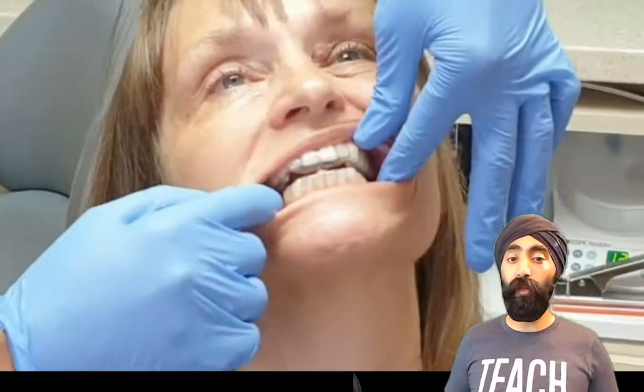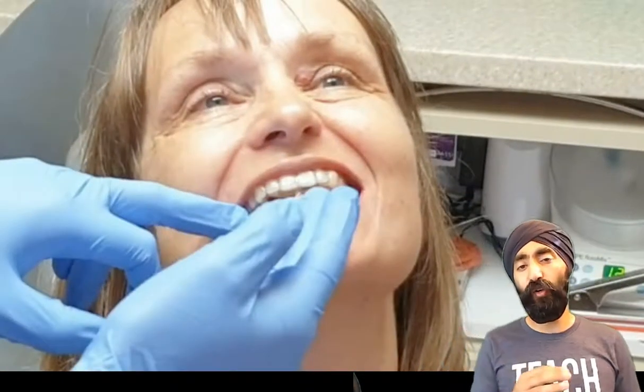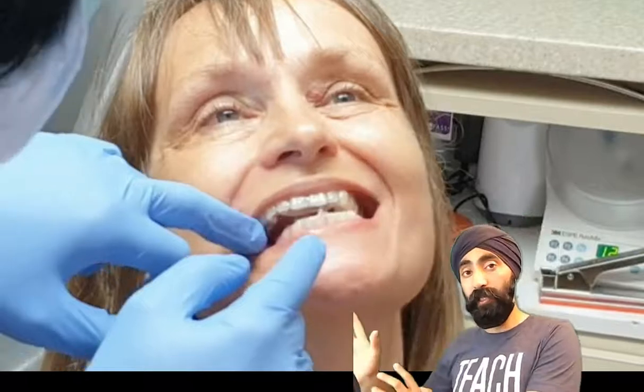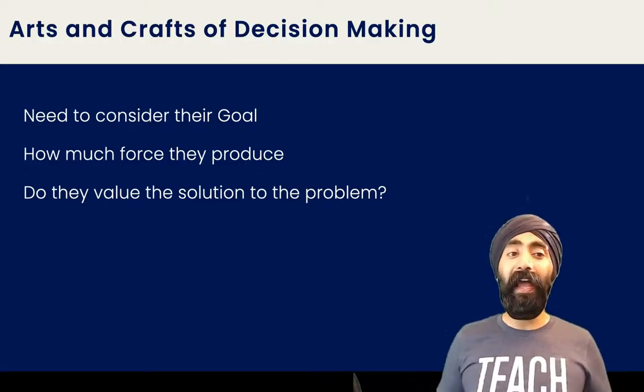So this is what it might look like as well. This is a two-piece one. This is called a dual arch B splint. So as the patient grinds left and right, the back teeth can't touch, okay? Therefore, the patient cannot generate enough force, okay? So we're keeping it to anterior guidance, okay? So it's a hard appliance, okay? It's easy to wear. It does increase the OVD a bit, but it's not so bulky. And I find that patients tolerate this really well. And it's much cheaper because it's so much easier to adjust, and it's plug and play, and it's really good.